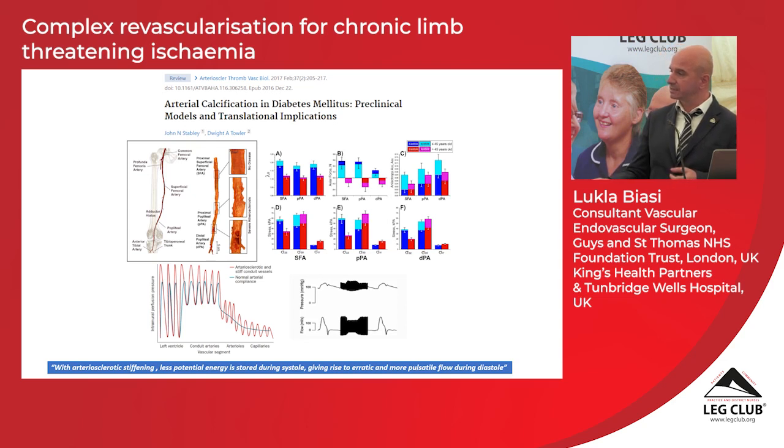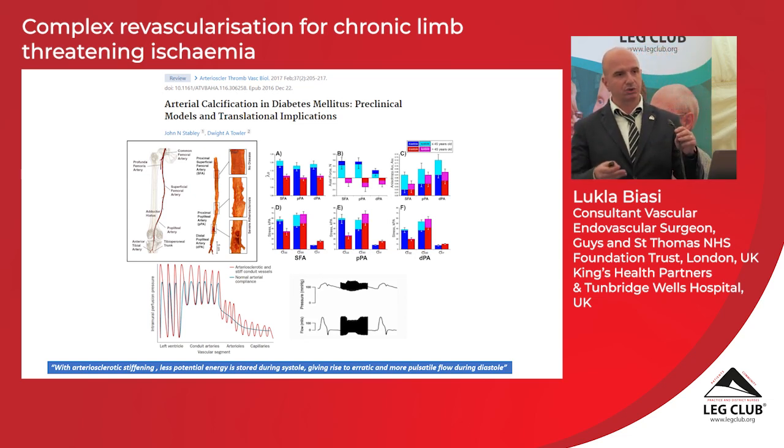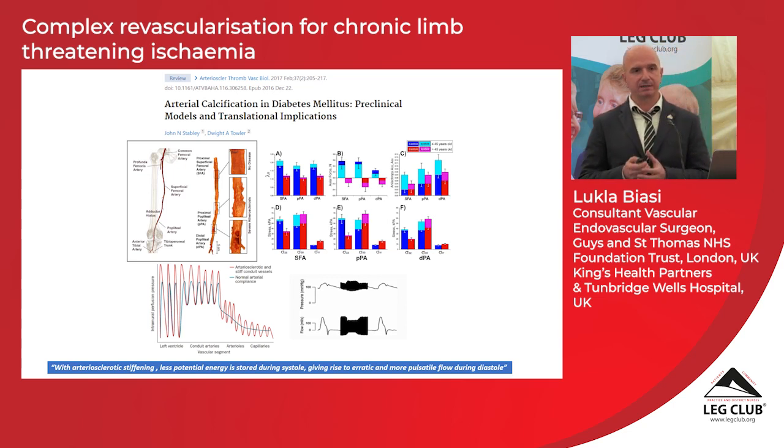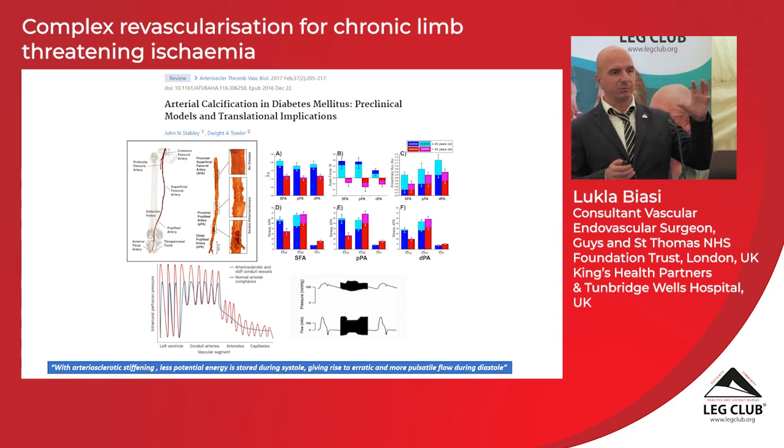And this study shows that there is a very exponential relationship between the calcification and your flow in the artery itself. And that's where the modern approach to vascular surgery comes into this game. We are now able to try to change the morphology and the compliance of the artery. So interestingly, we have moved from plain old balloon angioplasty or stenting, like 30 years ago, to a new way of doing keyhole endovascular surgery with drug-eluting technology.